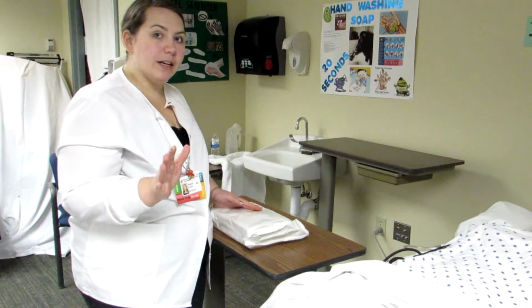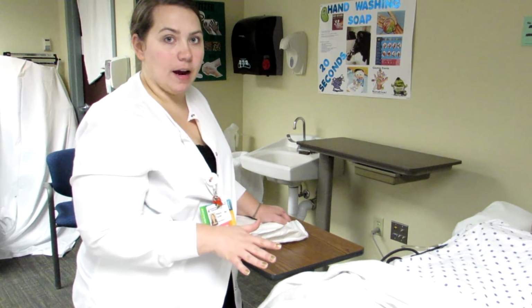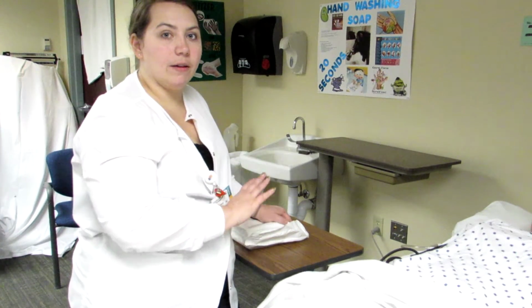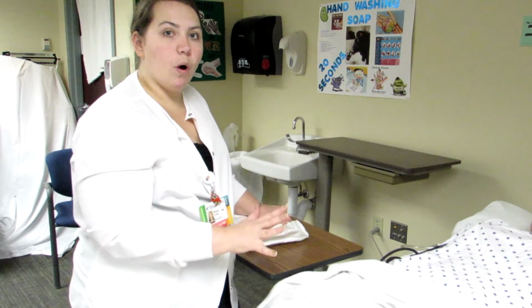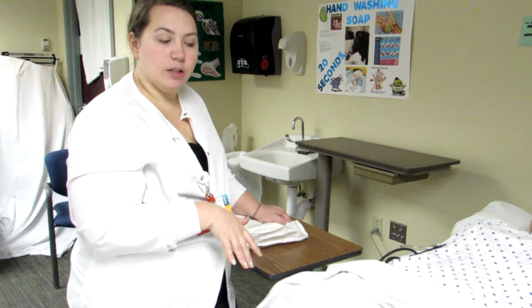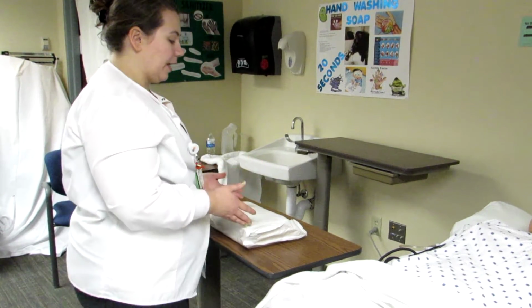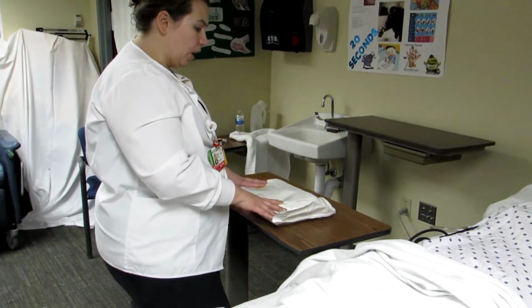So before you ever get started doing Foley catheter insertion, you absolutely want to make sure that you provide perineal care, especially if they're incontinent. Let's get that area nice and clean: soapy water, washcloths, clean the area, and then you can proceed with your procedure. So I did perineal care for Mrs. Smith, and I'm going to get my Foley catheter kit set up over here.